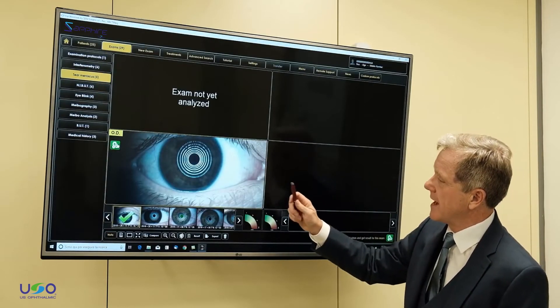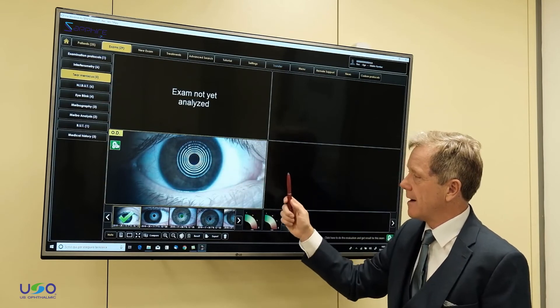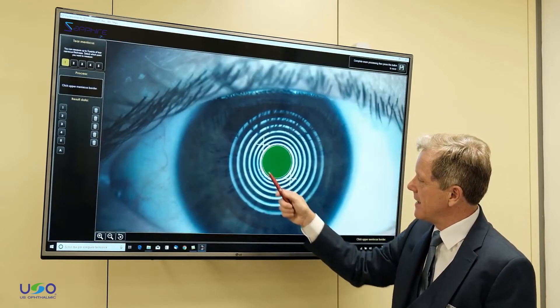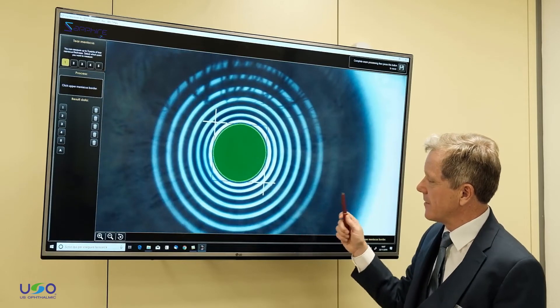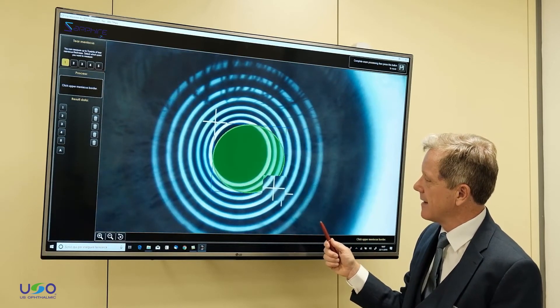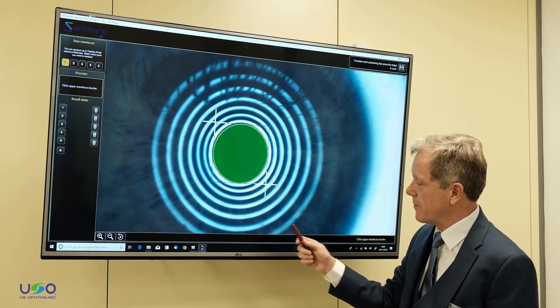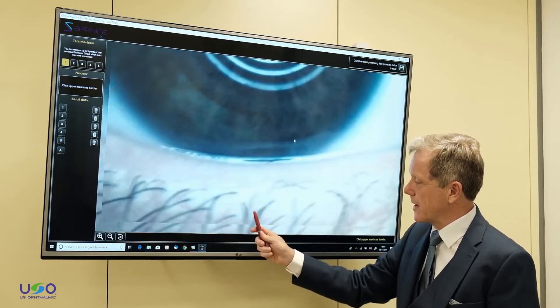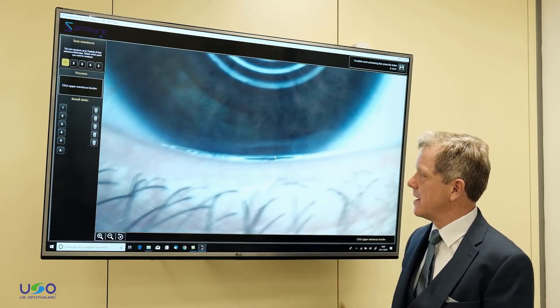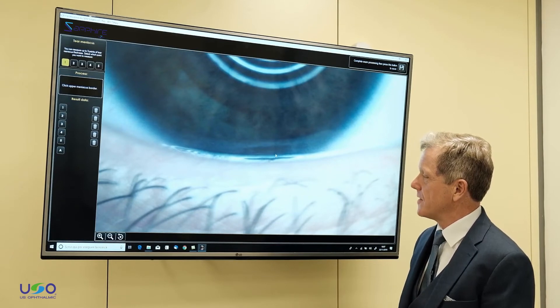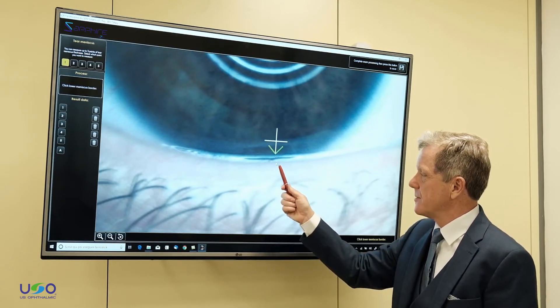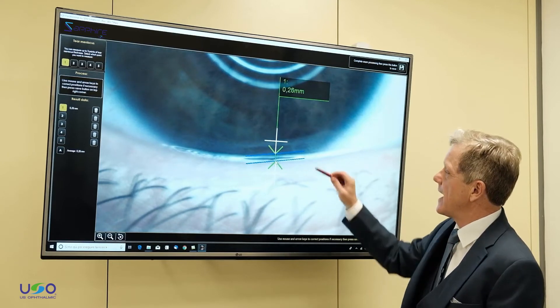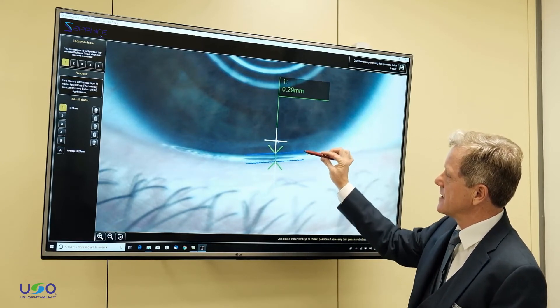You can then go through the processing procedure, calibrating the device by adjusting the green circle over the pupil area, then magnifying and bringing this up. We place the cursor and click on the top of the tear meniscus height, then the bottom on the lid margin itself, and that can then be adjusted in its orientation.